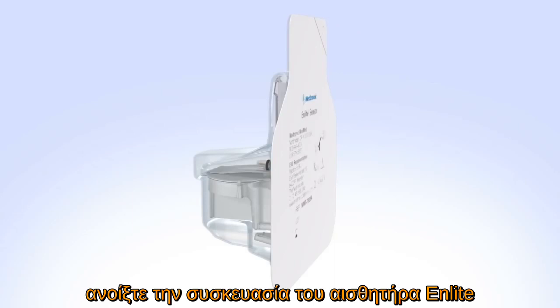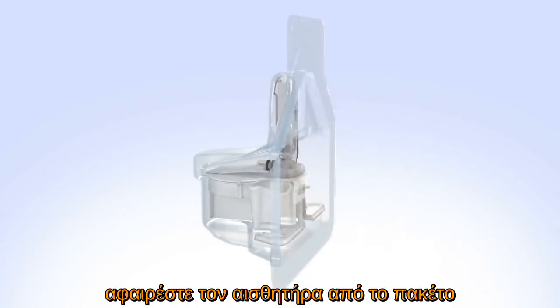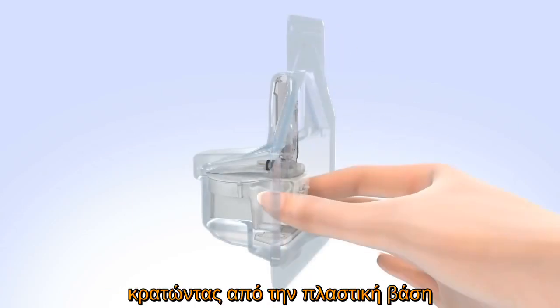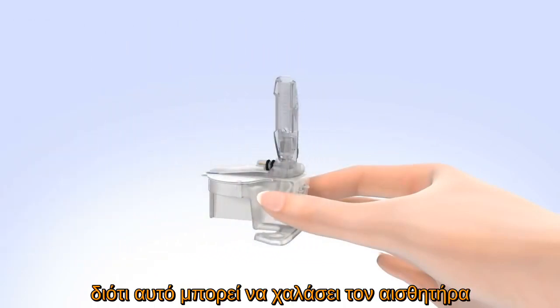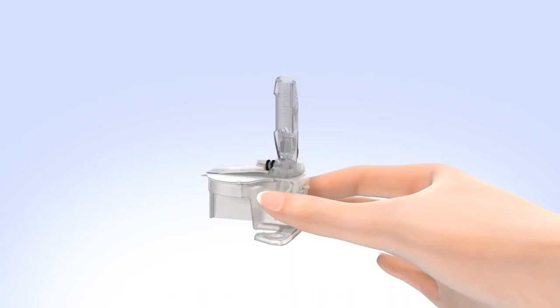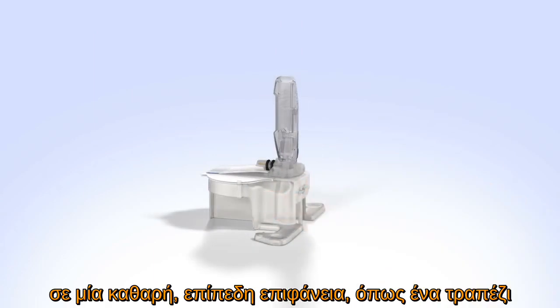Open the Enlite glucose sensor package. Remove the sensor from the package by holding the plastic pedestal. Do not hold it by the sensor or needle housing as this could damage the sensor. Place the sensor with pedestal on a clean flat surface such as a table.